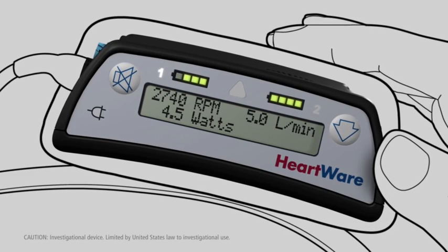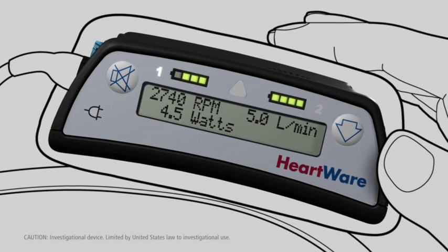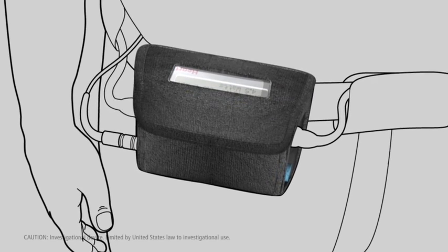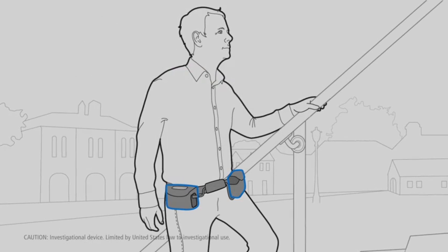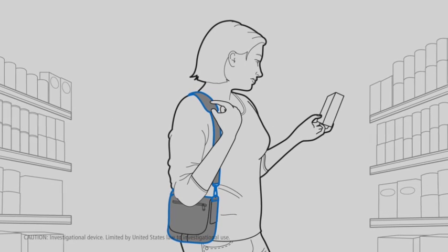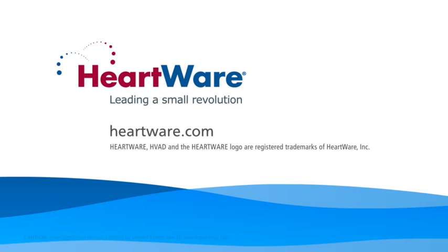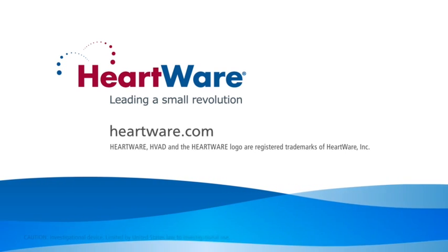The driveline cable, constructed with fatigue-resistant conductor wires similar to those used in pacemakers, exits the patient's skin and connects the implanted pump to an externally worn controller. The controller is powered by two lithium-ion batteries, or one battery plus an adapter connecting to a wall or vehicle electricity outlet.